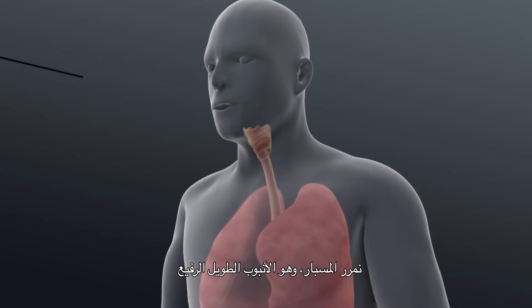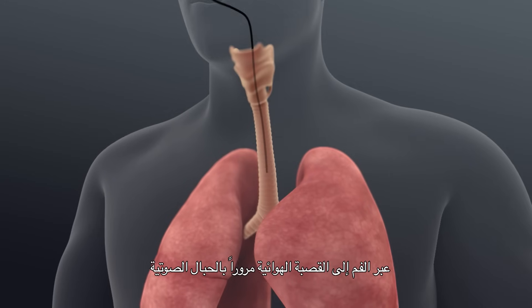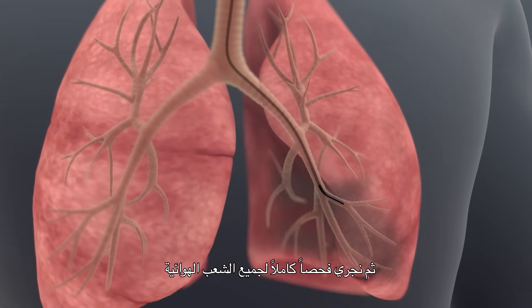Once the patient is comfortable and the throat is numb, we will pass the bronchoscope — this long thin tube — through the mouth and into the main windpipe, past the vocal cords. After that, a full inspection of all the airways will be performed.